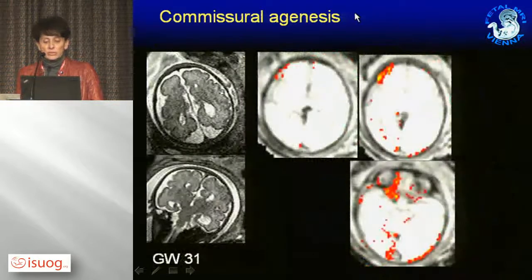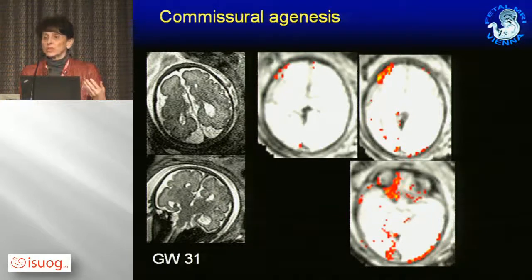Gestation week 32. Here we have a fetus in gestation week 31 with a much nicer brain. There is much more brain, but we could not find as much activity as in the fetus before. At the moment, this is still experimental work, but we have the hope that when we get more experience, that we might be able to tell you something about brain function in these cases.